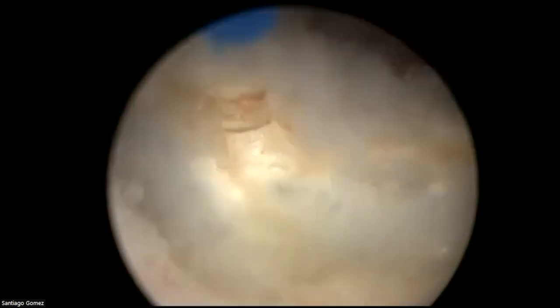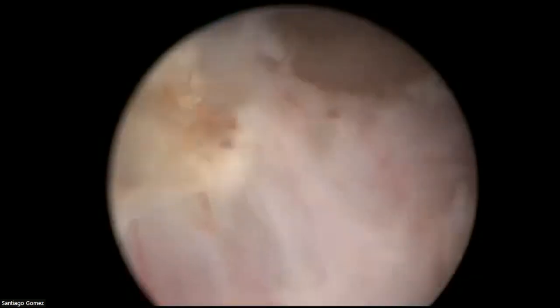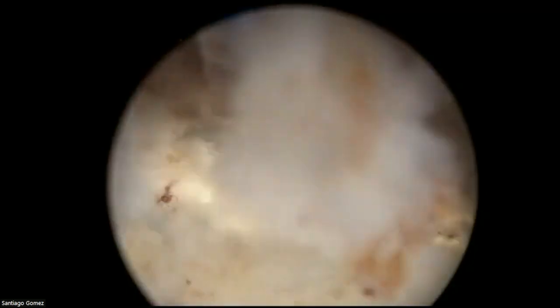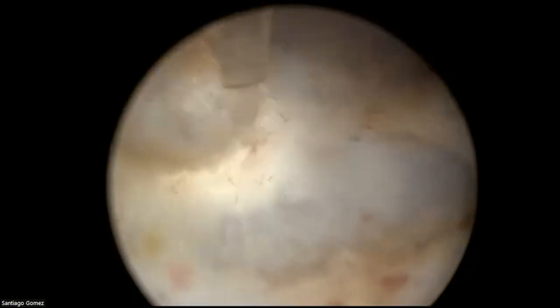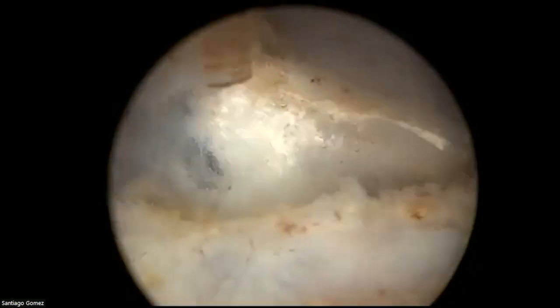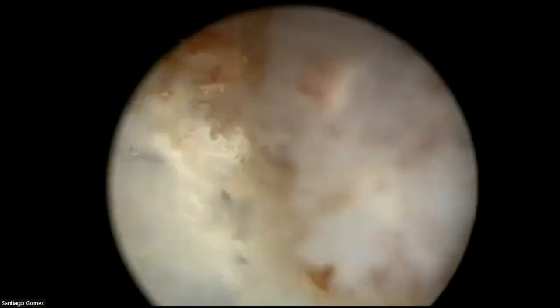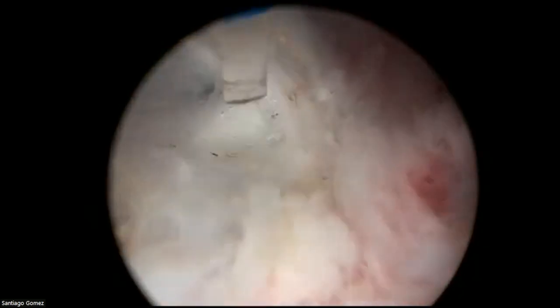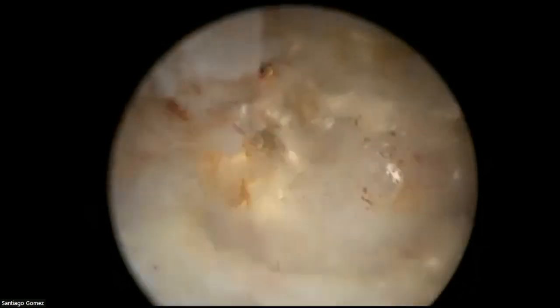I hope I can show you. You see this tissue that we see here is a little bit yellow in color, and I'm deepening my dissection a little bit more to check. Of course, at the beginning you're happy if you can remove the adenoma. Maybe you don't see these subtle changes in the capsule, but as you get more experienced, you start seeing that maybe you're leaving some tissue behind.